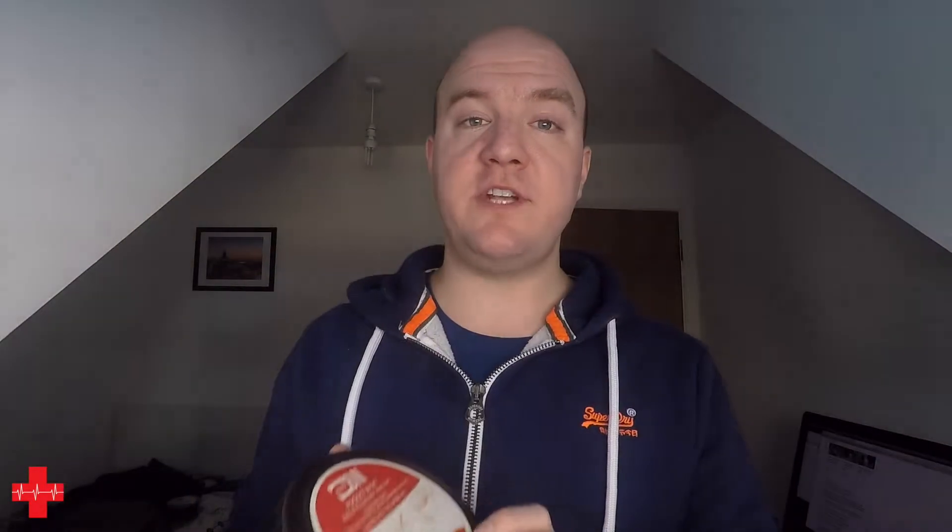Believe it or not, this small piece of kit is a bag valve mask known as the Pocket BVM, made by a company called Micro BVM. Now this is not the cheapest or the most widely available BVM you can get at the moment, but this is one that I really enjoy.